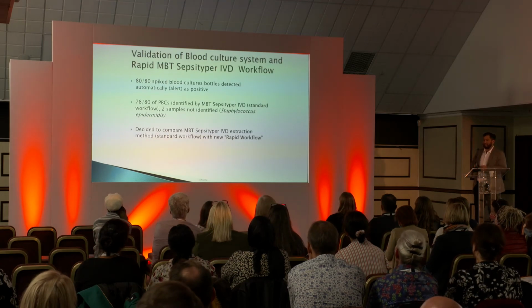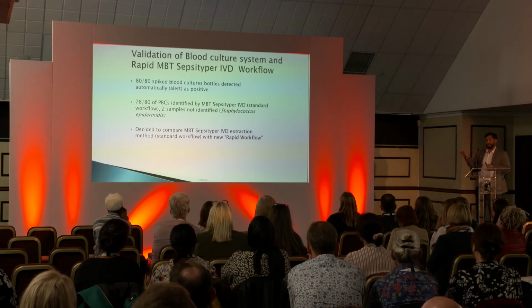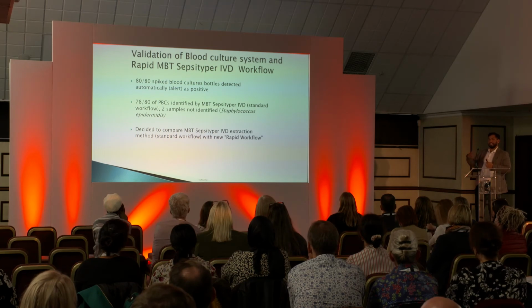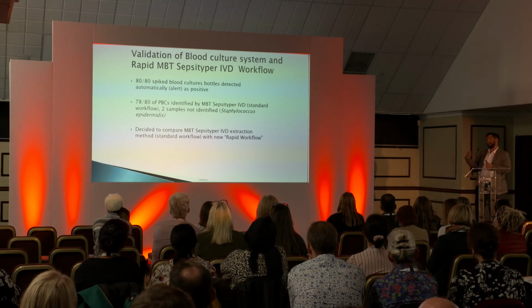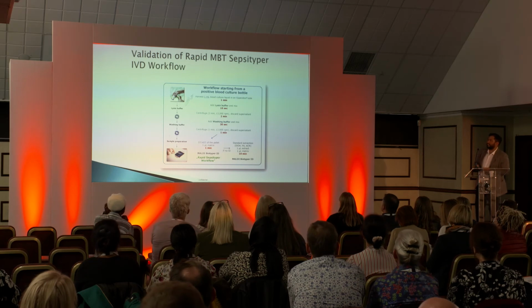And then basically what we did is we followed the Sepsityper method, using the normal Sepsityper method as prescribed by the protocol, but then also did a reduced one. So using the same workflow, but reducing a step, so you're just using the pellet directly rather than doing some extra washes. So this is the workflow as it goes.